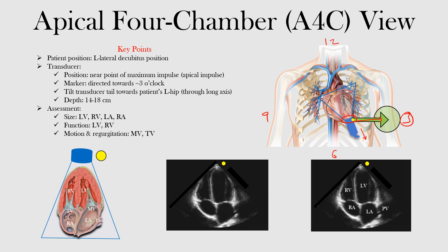We want to tilt the transducer towards the patient's left hip. Remember, if this is the right side of the patient, this is the left side — here's the arrow going towards the patient's left hip. We're going to direct the ultrasound beam through the long axis of the heart. The depth can be about 14 to 18 centimeters, and we can adjust it based on the patient.